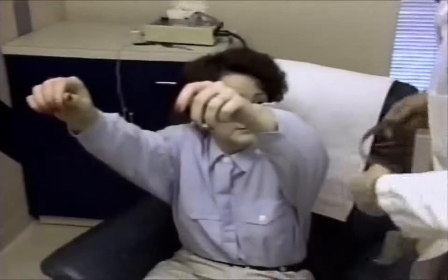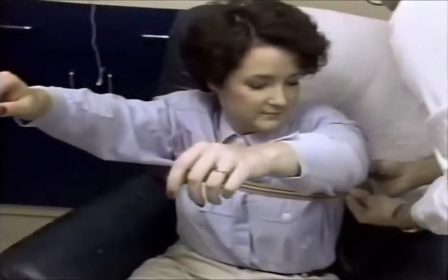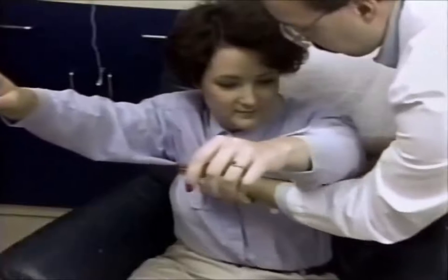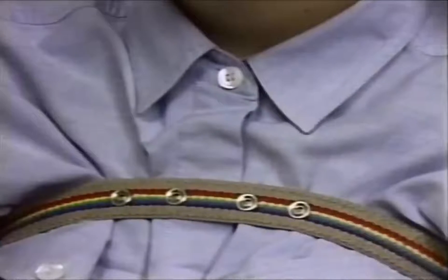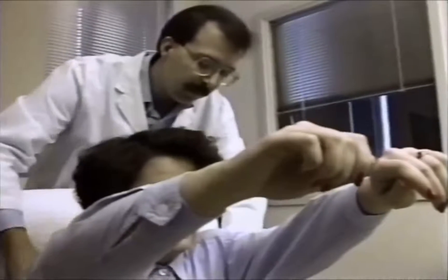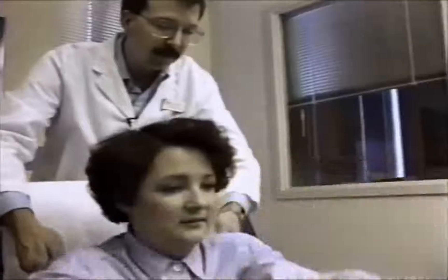Place the body harness around the chest and under the armpits, and fasten the velcro straps together, making sure the snaps are in front and centered on the chest. The strap should be snug but not uncomfortable. Once confirmed, the patient can put their arms down and lean back in the chair.